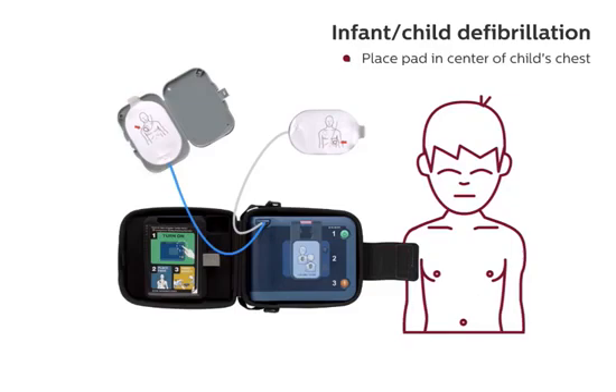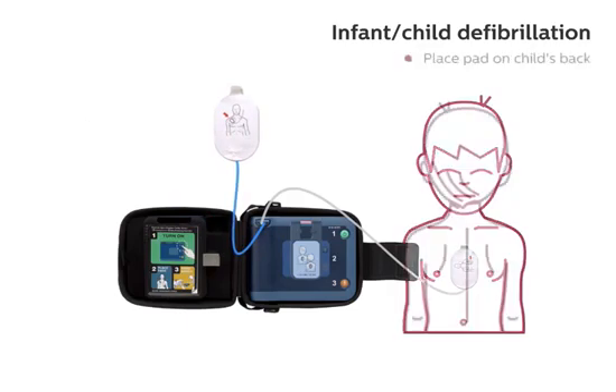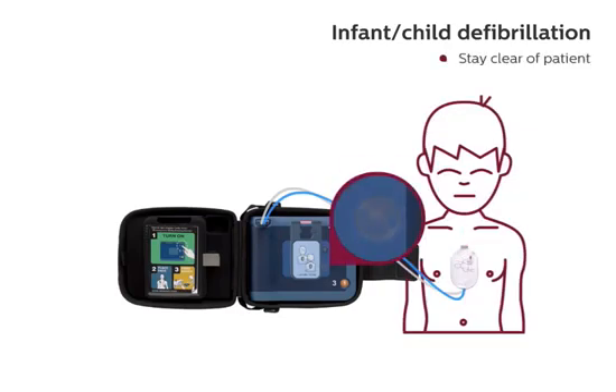Peel one white pad from the gray case. Place pad in center of child's chest and press firmly to bare skin. When the first pad is in place, peel the second pad. Place pad on child's back and press firmly to bare skin. Stay clear of patient.